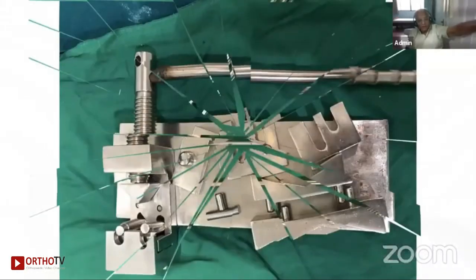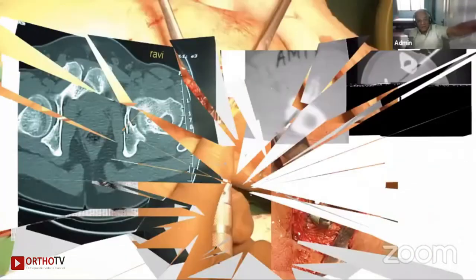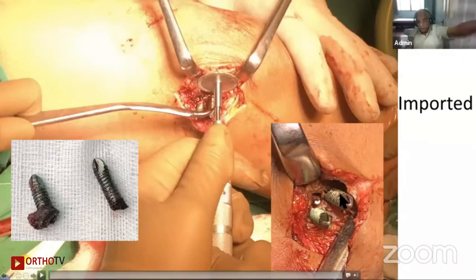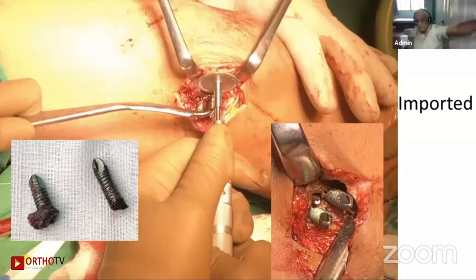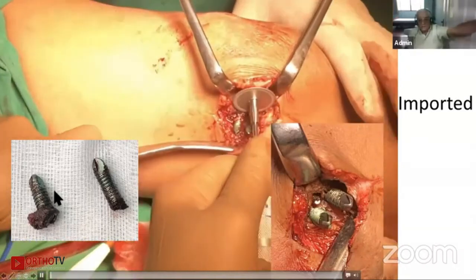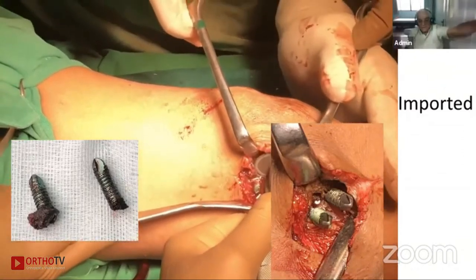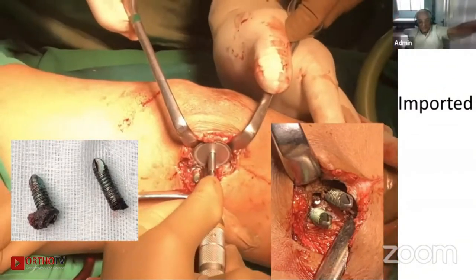Now, this is the one, this screw was jutting out like this. And it was hurting him because the surgeon did the distal femur, and radiologically the screws were out. And it was impossible for me to take it out from the lateral side. And so here it is, you need this wire cutter. This is the metal cutter bar. You can take this metal cutter bar and it just comes out.